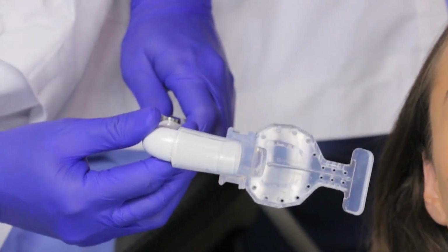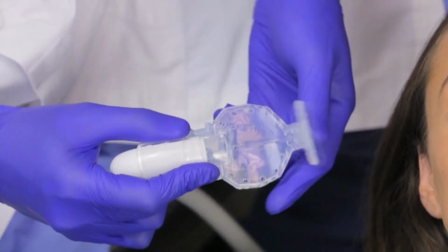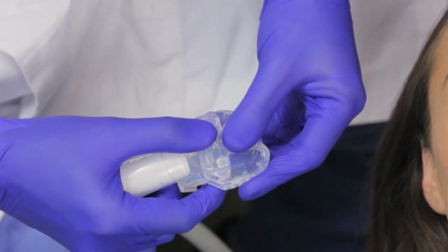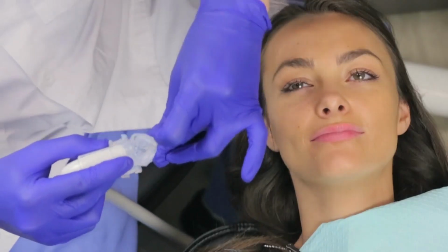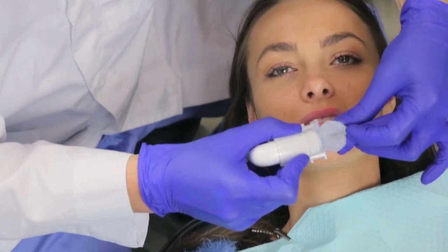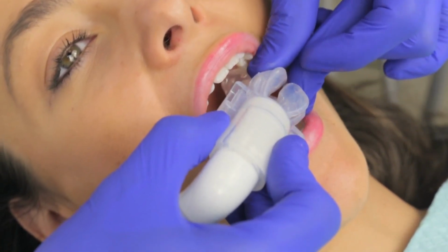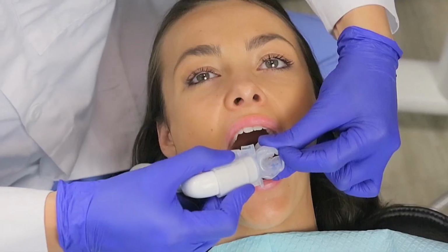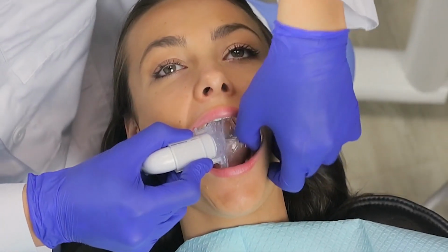First, turn the lever on. Before inserting the mouthpiece, fold the tail towards the center of the mouthpiece. Next, fold the sides together. Ask the patient to open their mouth while reminding them to focus on breathing through their nose to promote relaxation. Slowly insert the mouthpiece, lining up the front edge of the bite block with the distal of the canine. Then, let go of the mouthpiece, letting it adapt to the oral cavity.